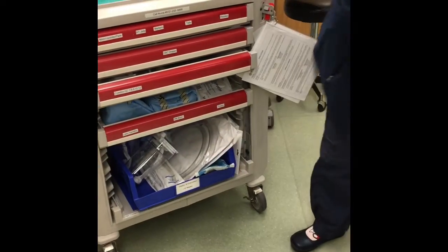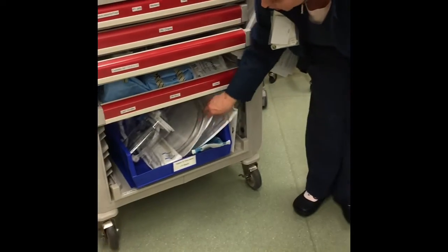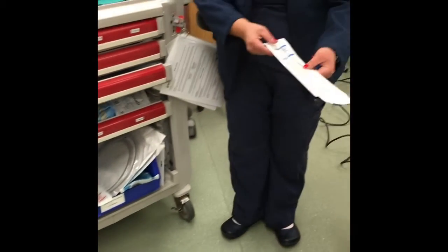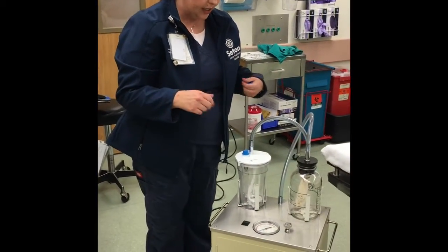This is a different size tubing, however, and your specimen is going to collect in the inside and the sock instead. So this would be a different tubing, which is all down here together, and bigger curettes. They're 16 and 14. So if you had to do that, that is what you would do. At the end of the procedure, you're all done.